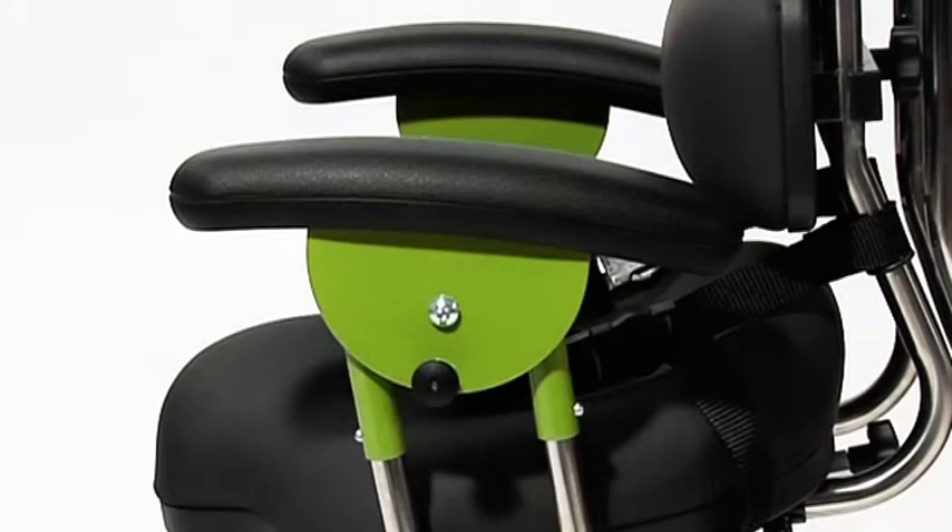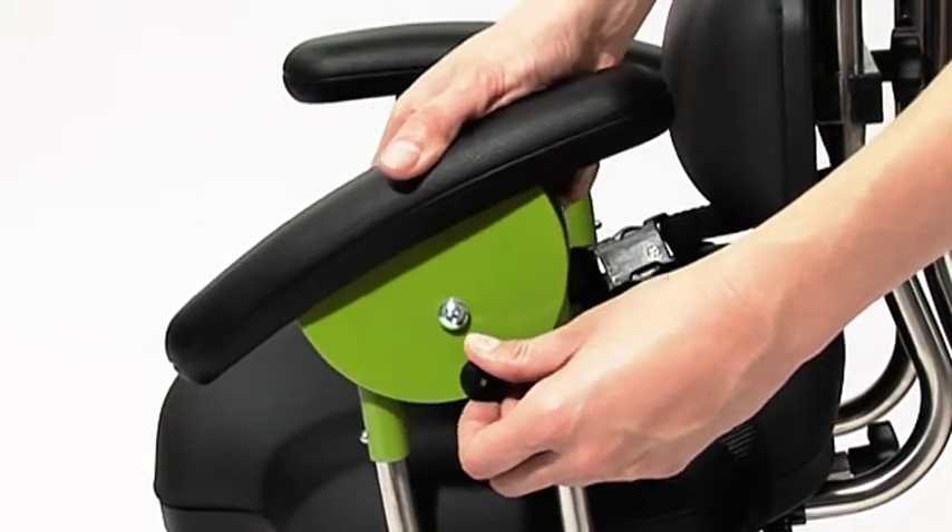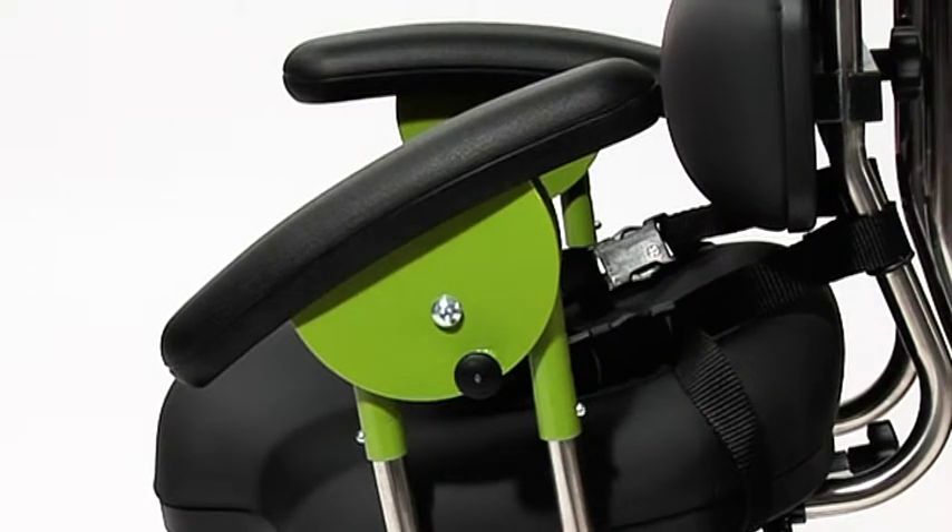To adjust the angle of the armrests, pull the spring plunger. Tilt the armrests to the desired position, then ensure the spring plunger is re-engaged.